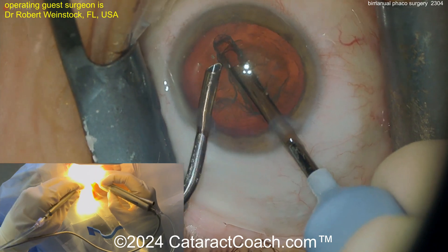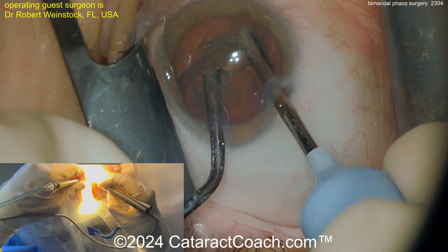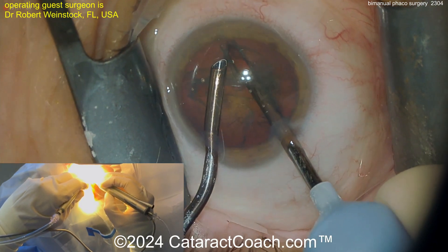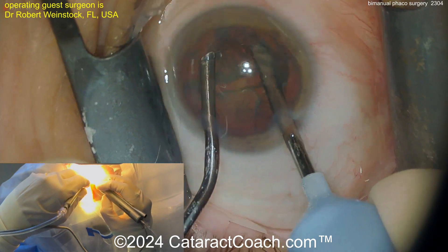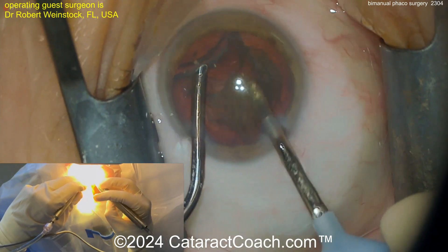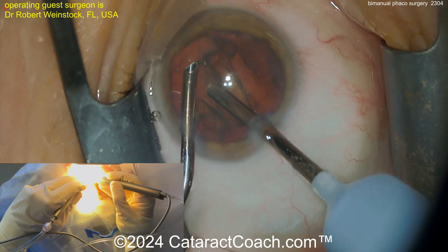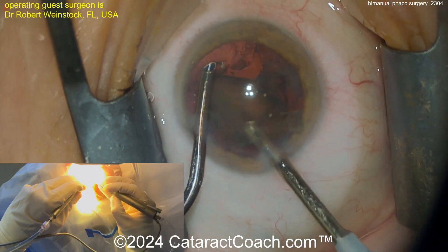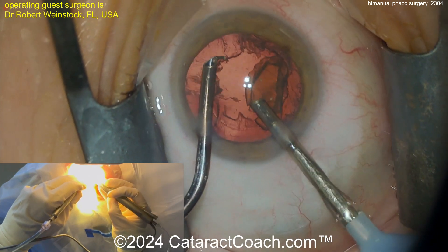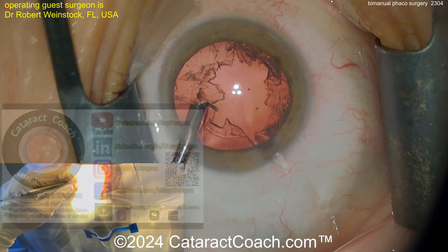You really have to master phaco power modulations because you have the metal needle in direct contact with the cornea. If you use continuous phaco energy, you're going to have a corneal wound burn in a second. The silicone sleeve is protective against a phaco wound burn, and the fluid flowing out through the main incision also helps cool the cornea. Here you don't have that — look how little fluid leakage there is. These are pretty much watertight incisions, so there's not much cooling on the phaco needle. If you've got a dense cataract and you're doing bimanual phaco, be careful.